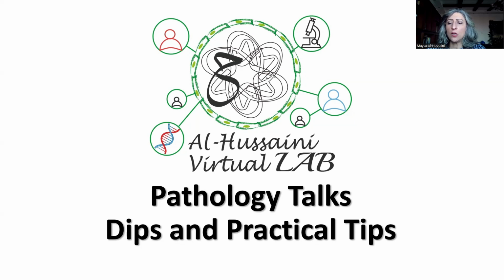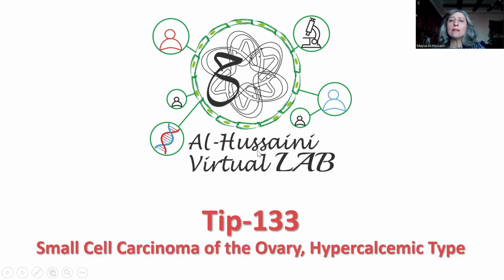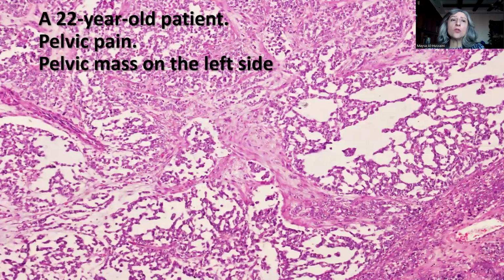What I'm going to be sharing with you today is actually a very nice case of a rare tumor entity that occurs in the ovary, which is small cell carcinoma, hypercalcemic type. This is a case of a 22-year-old female patient who presented with pelvic pain and was found to have a left-sided pelvic mass. At that time, they were not sure whether this involved the ovary or not.